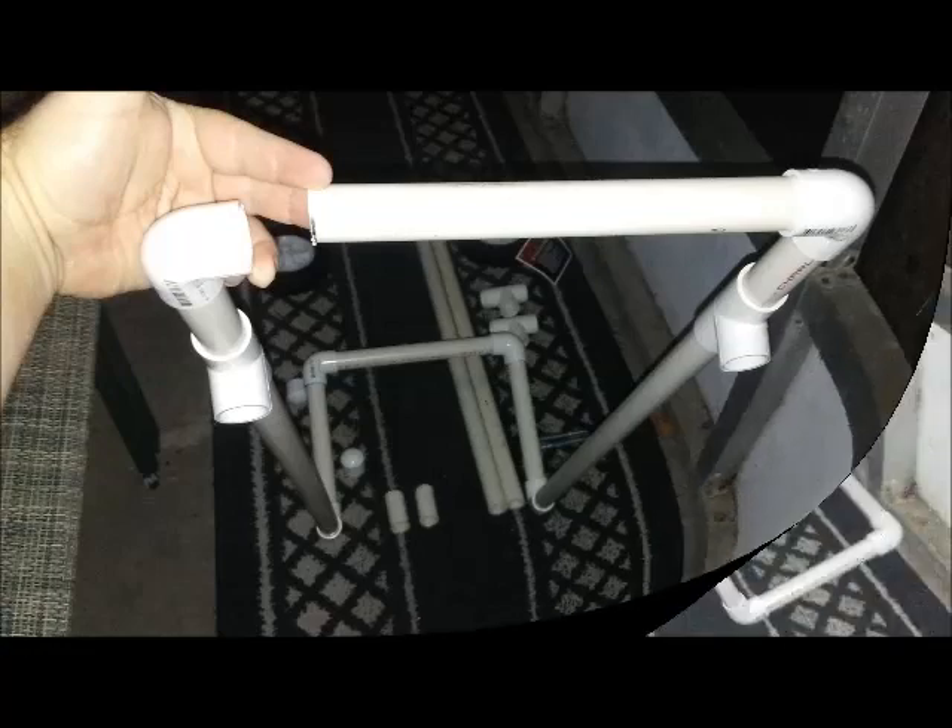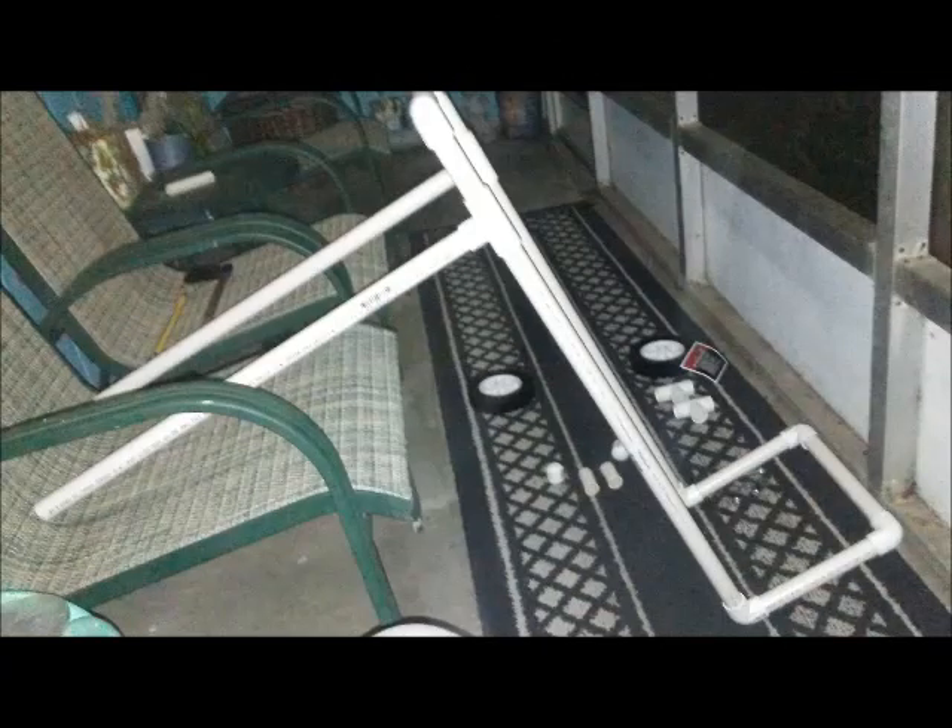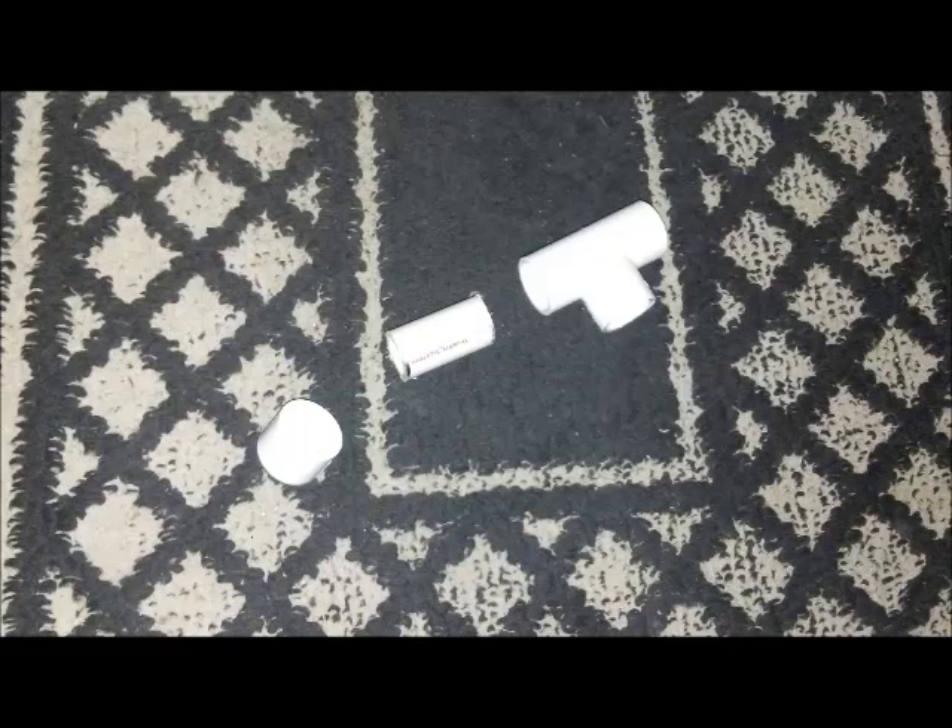In the middle of those two connectors, put the other one of the number six neck length pieces. Then from the bottom part of those two number five T-connectors, put the two body length poles inside there to make your full T-structure.